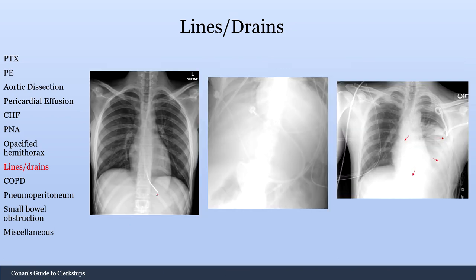This picture depicts an NG tube terminating past the gastroesophageal junction — that is exactly where you want to see it. A few things that could go wrong include the tube going into the trachea, tracking down the trachea and coiling up in the lung. You need to get the X-ray to make sure that's not happening, because starting tube feeds with an NG tube in the lung would cause a massive pneumonia.